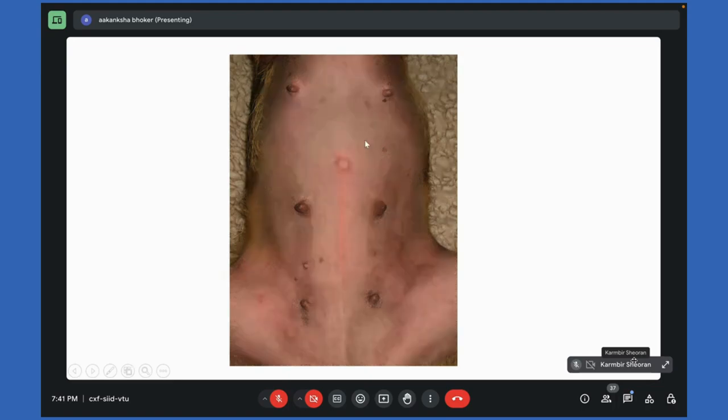And here only the spleen will be located. This will be the head of the spleen. The tail will be somewhere maybe towards the bladder, or it can go towards the right side. Then this is the area of the stomach. From the stomach there will be the duodenum. The duodenum will descend here, and this entire area is the liver, left liver, right liver.